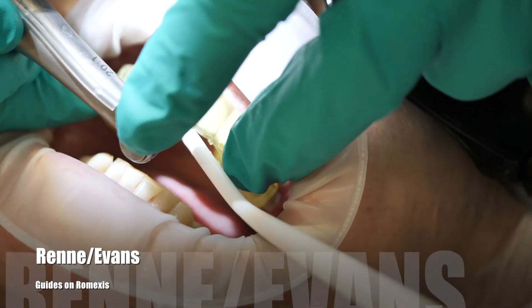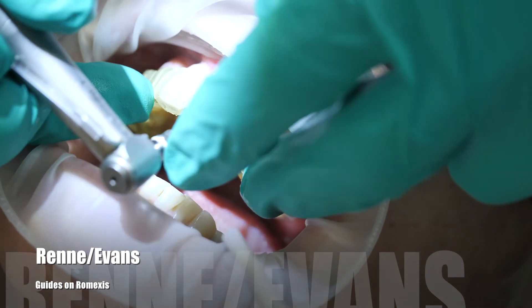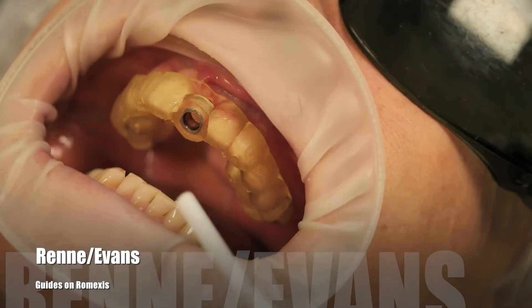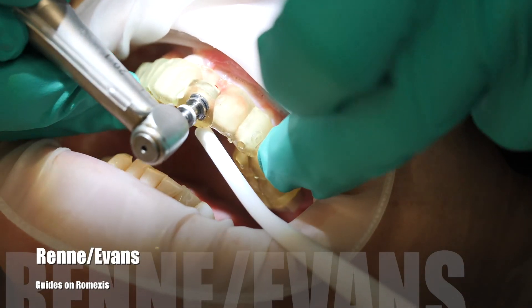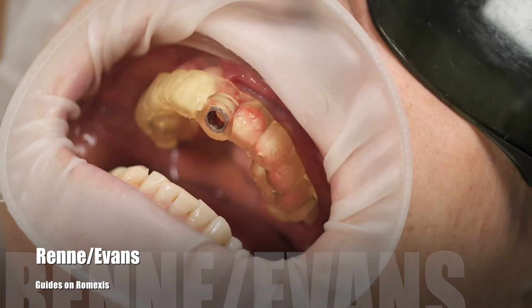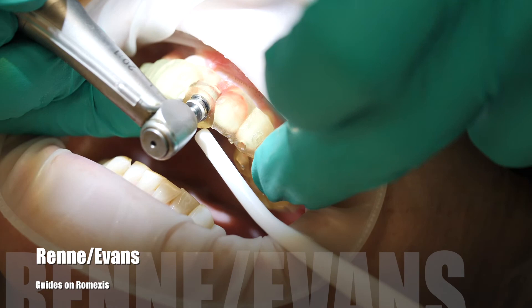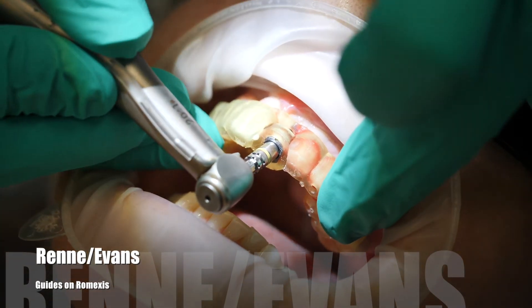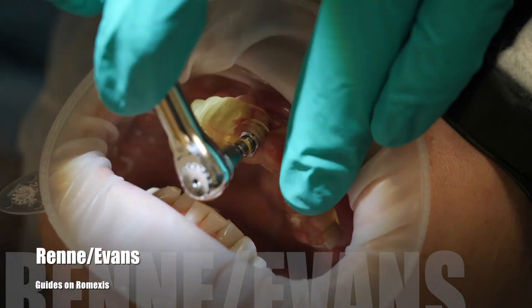Here we are with Dr. Evans on the surgery. It took him about five minutes to do the whole surgery — literal real time. It's flapless, it's easy for the patient, she had no discomfort at all, and we had good torque values. That's just the simple workflow, guys. Can't wait to see all your cases and all the cool stuff you do with it.